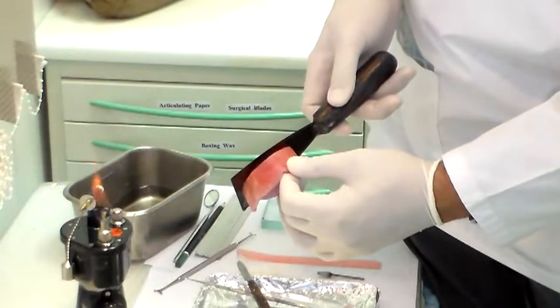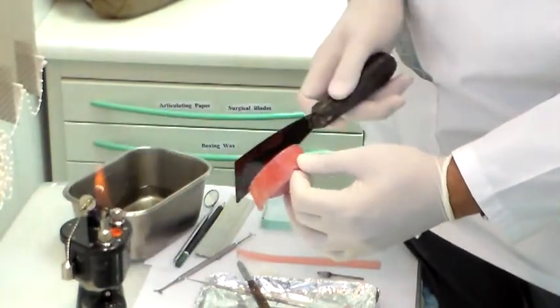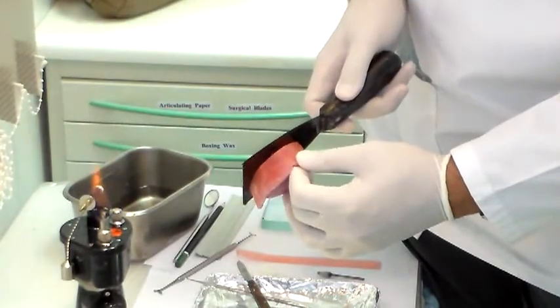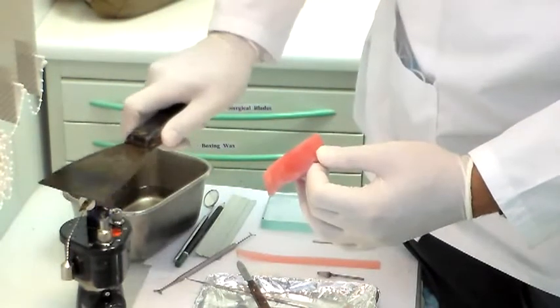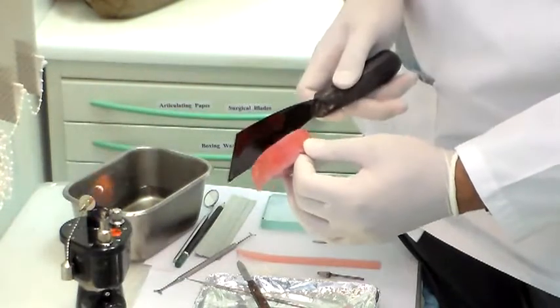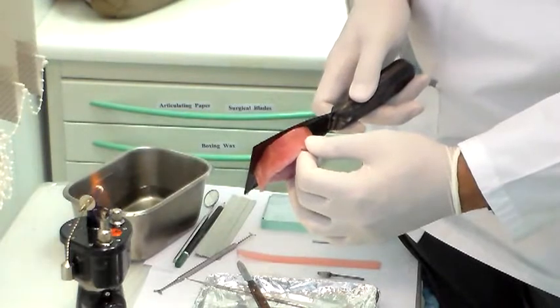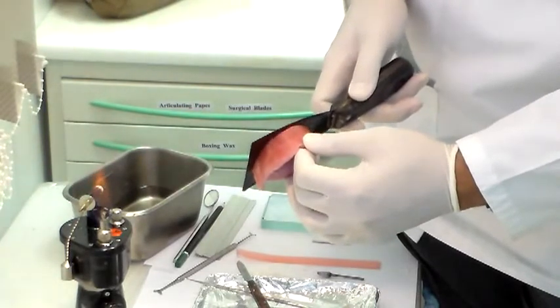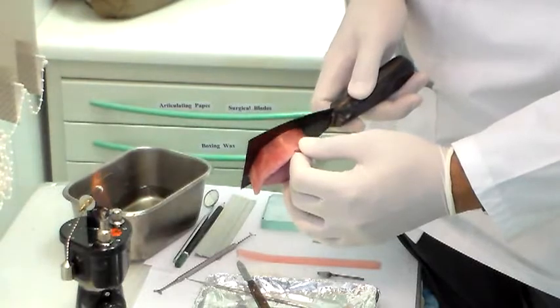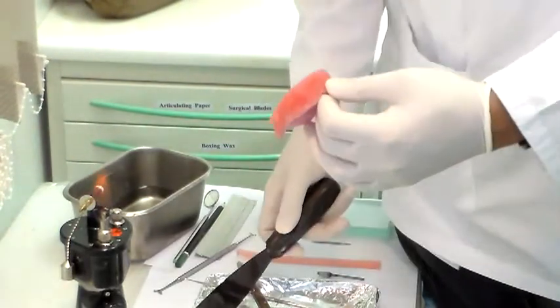Keep reducing them together. Heat up nicely all over and use them together until the posterior touches the anterior portion. The moment it touches the anterior portion, you stop — and only then will you get a flat surface.